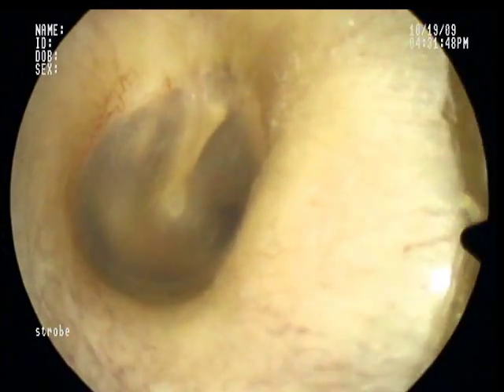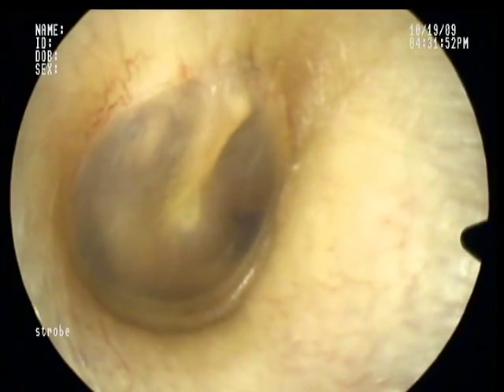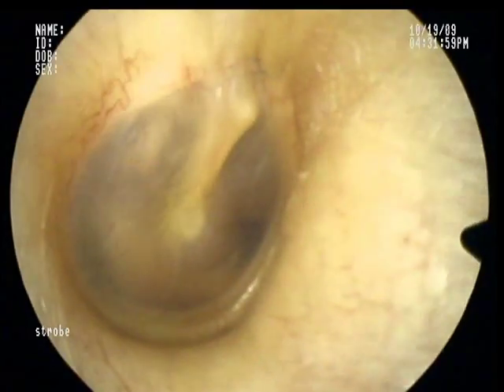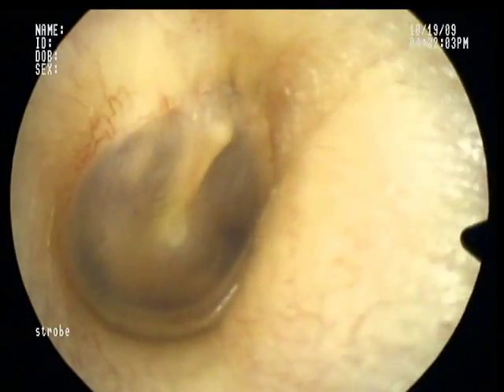This is Dr. Ryan Kaufman and this is an endoscopic view of my right tympanic membrane. You can see the main bone running down the middle of the eardrum called the malleus. In the back part of the eardrum you can also see the incus and stapes superstructure.